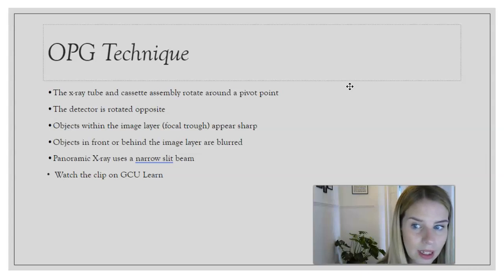Definitely something that I was quite nervous about doing when I first qualified, and I was working in Manchester, and they did come through the door late at night, and it was a kid, and I really did feel quite stressed about it. But hopefully you'll have good instructions on how to use the machine, and you'll have practiced and you'll feel quite confident. So even if you're out in your normal placements now and it's something that you're not that confident with, now is the time to start saying, can you just run through the OPG machine with me, just so that I feel more confident when I qualify.